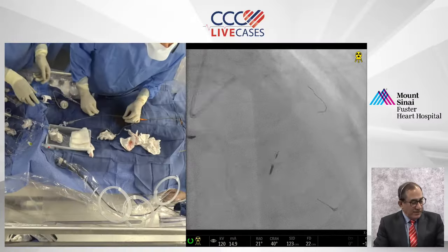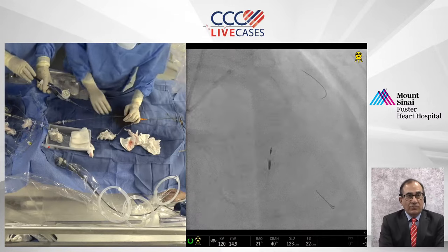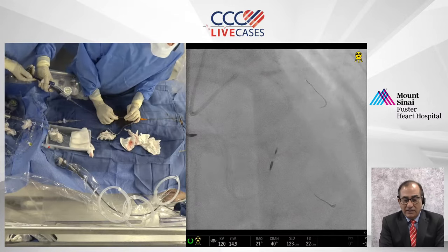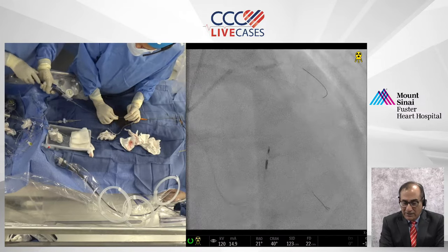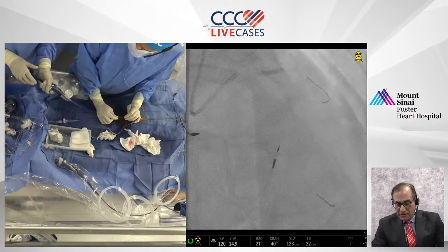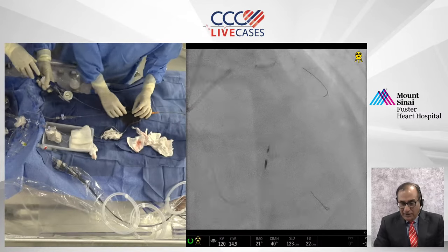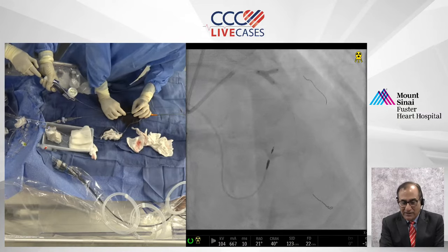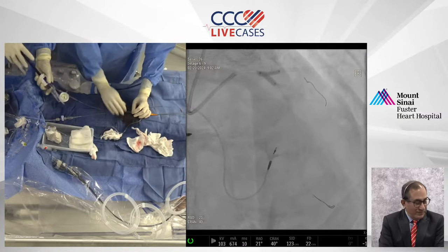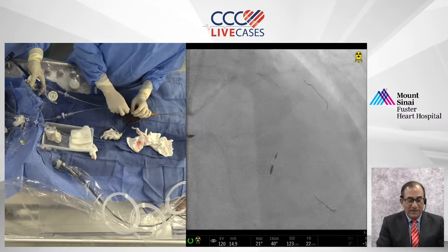Many people have continued to discuss whether you are going to go to the diagonal in the proximal part of the strut or distal part. Suggestions also by Dr. Mahmoud El Rais, I think from Egypt, whether you would have considered a ping pong technique for the simultaneous deployment of D1, D2. No, how can you have done simultaneous? You needed nine French guide.